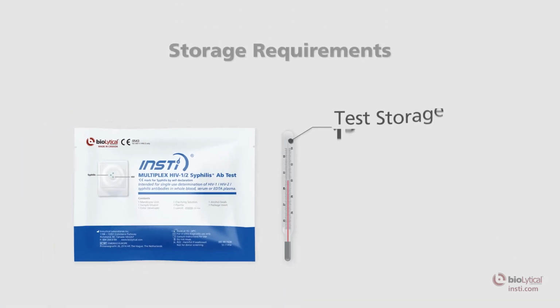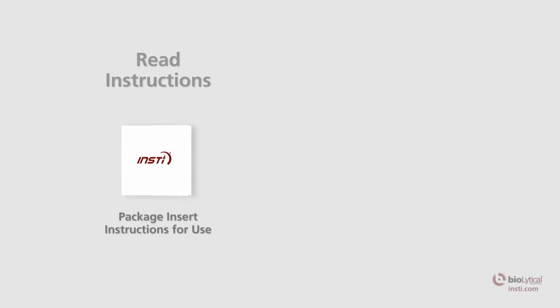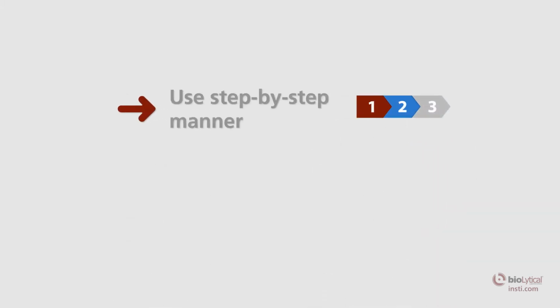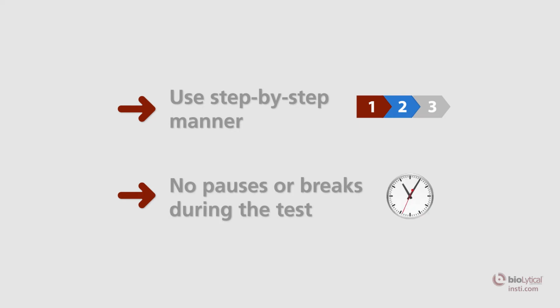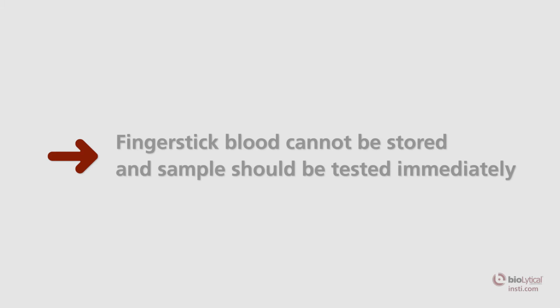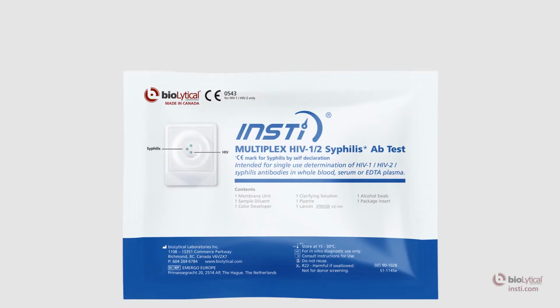The test must be stored at 15 to 30 degrees Celsius or 59 to 86 degrees Fahrenheit. Before using the test, read the package insert to familiarize yourself with INSTI and become familiar with universal precautions. INSTI is intended to be used in a step-by-step manner with no pauses or breaks during the testing process. Whole blood specimens collected by fingerstick should be tested immediately.